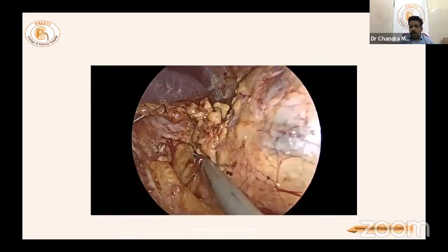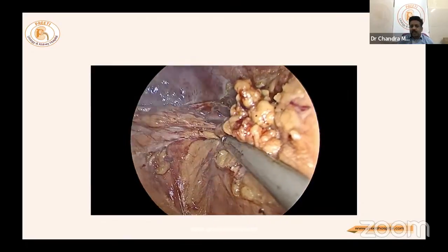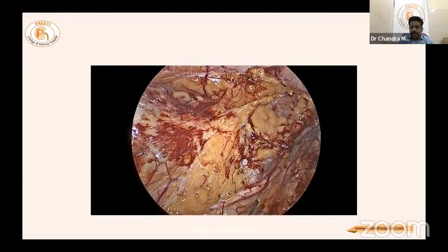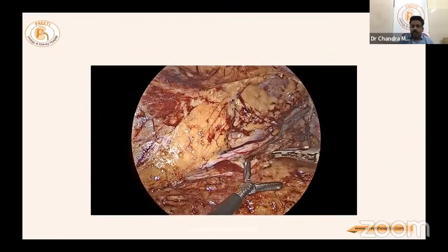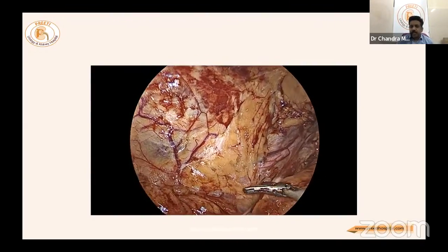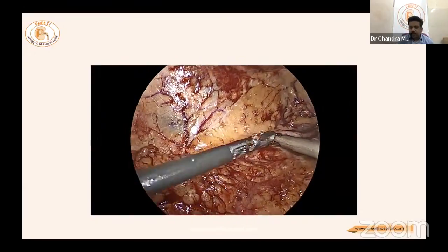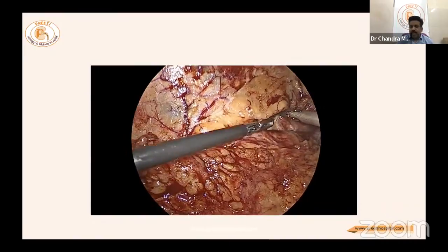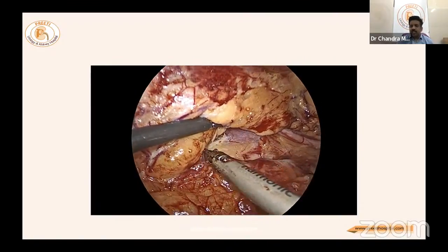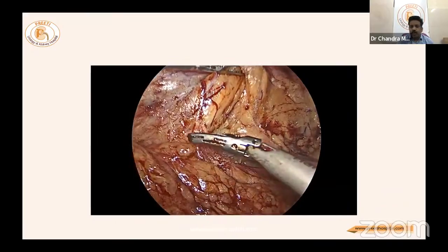In Gerota's plane, go up to the splenorenal ligament, divide it, then retract the spleen medially with the left-hand retractor, and the spleen will fall toward the medial ligament. The ureter is now identified. You should stay quite away from the ureter because there are chances of ureteric ischemia when separating it from the lower pole — the golden triangle — risking ureteric stricture.